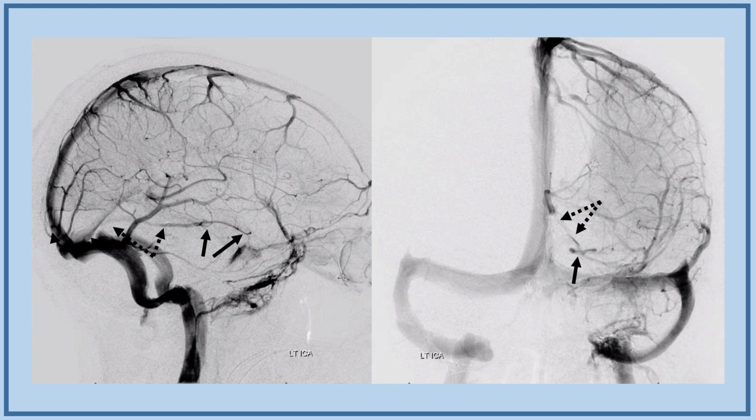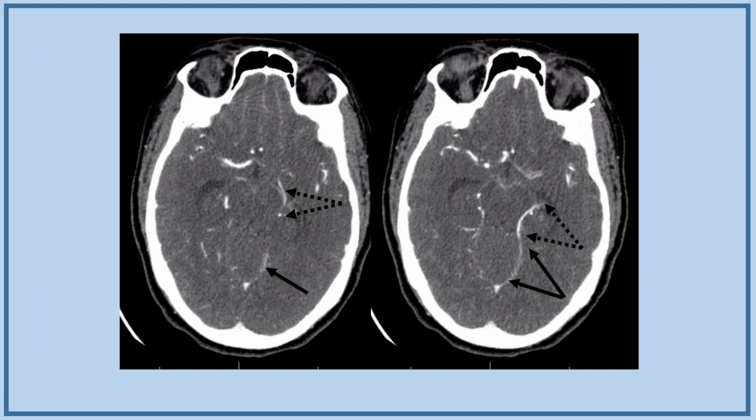You can see the flattened kind of appearance of this segment because it's running in the dura of the tentorium cerebelli, joining the proximal aspect of the straight sinus. And with that, we've given you the anatomy and a little bit of intervention. And we thank you very much.